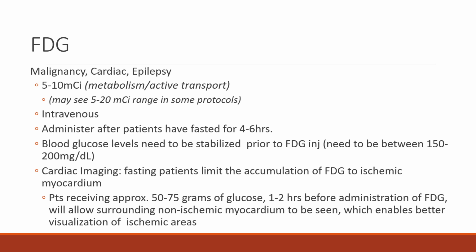So when we talk about FDG, keep that in mind that FDG is not going away, and it is still very valuable and useful in patients that even are undergoing imaging with PSMA or dotatate or fluorestradiol.